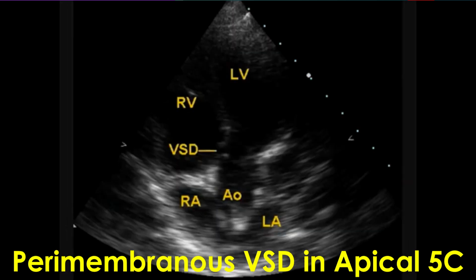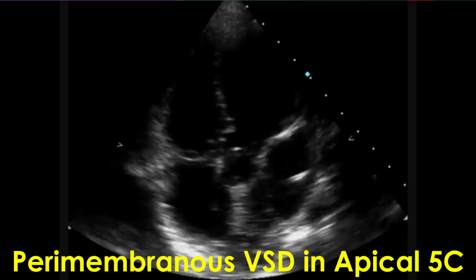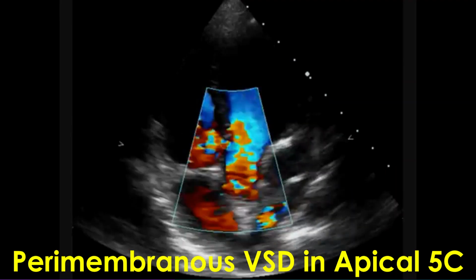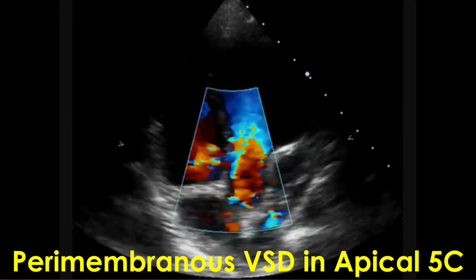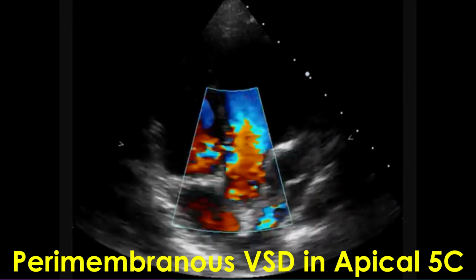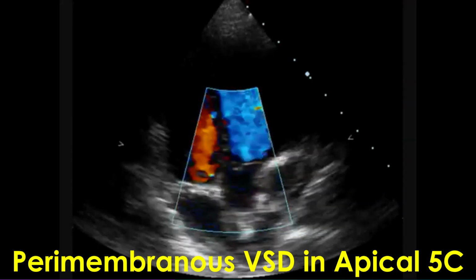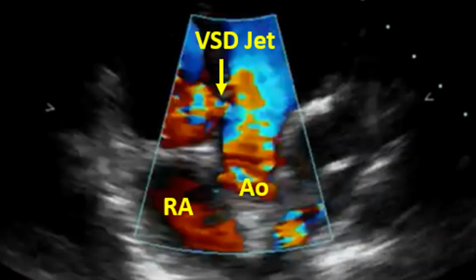Apical 5-chamber view showing the subaortic perimembranous ventricular septal defect. Sometimes it may be associated with aortic regurgitation, though not seen in this case. Color Doppler imaging in apical 5-chamber view showing the left to right shunt across the subaortic ventricular septal defect into the right ventricle. Still frame in apical 5-chamber view showing the VSD jet.